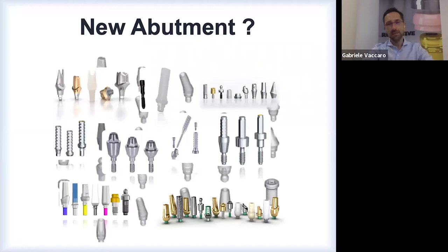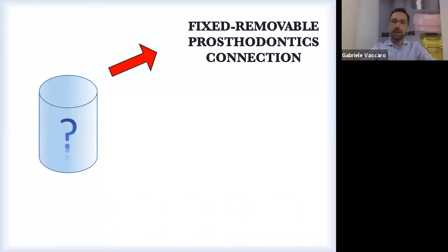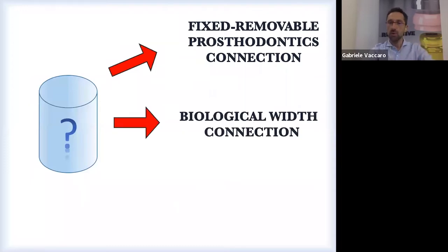And they are starting to confuse our practice. But what are the main characteristics that we have to look for in an abutment? Why do we look for that specific abutment? The abutment is the link with the fixed or removable prosthodontic connection. It's the link between the implant and the teeth. It has a pivotal role in the game.